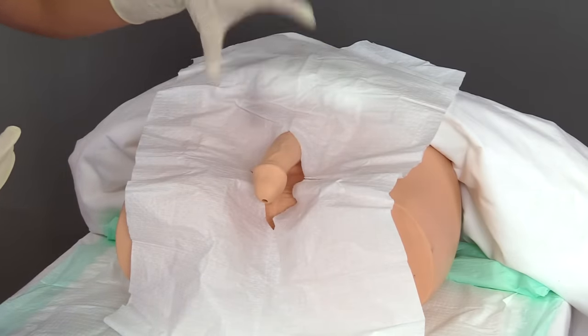Now that I'm in position, I'm going to remove my non-dominant hand — the insertion portion is complete. I'll hold the catheter in place with that hand to prevent the bladder from contracting it out, while my dominant hand inflates the balloon. The patient should not report any pain during balloon inflation. Once the balloon is inflated, disconnect and discard the syringe. Gently pull back on the catheter — a little resistance confirms the balloon is seated in the bladder.